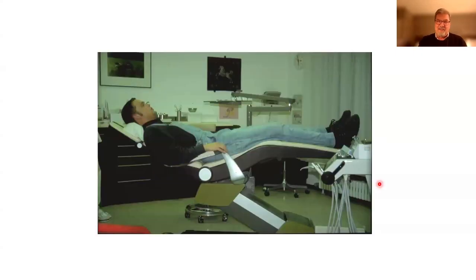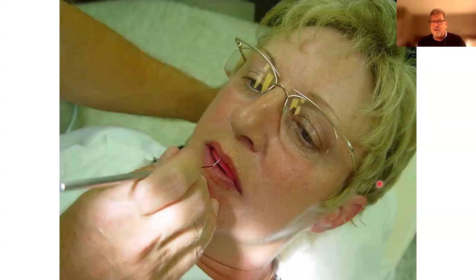This patient here, no. We don't want the patient in that position, even with taking an impression, because you get the impression I showed you before. So we want to raise that patient up in an upright position. So this is some old slides here. I show these just to give you the information of what we need at a laboratory level and what you should be doing in the operatory.